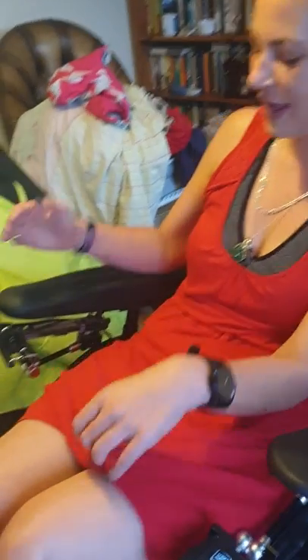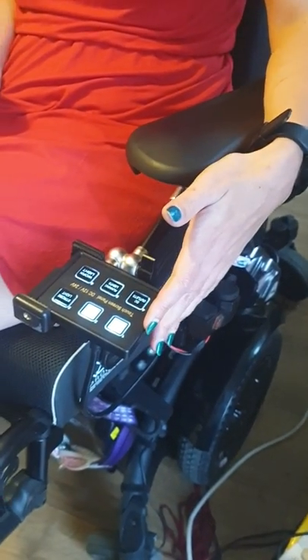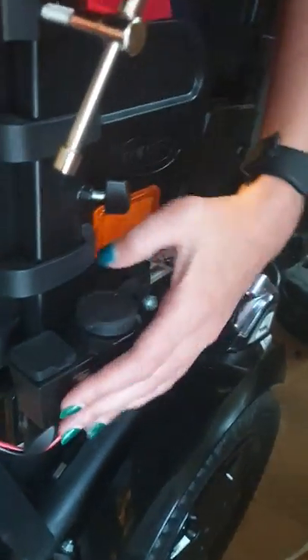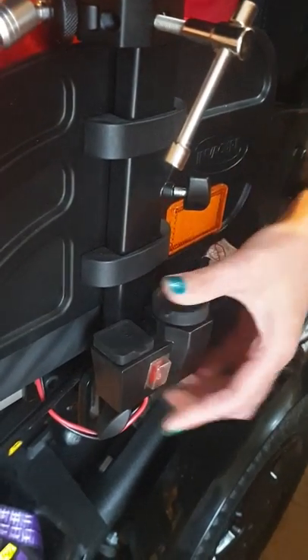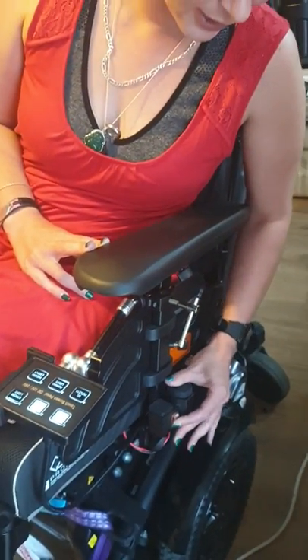We're going to do something about that because we've got other features on it. That's still better than my old horn though. We're going to do stuff on that. And you've also got a phone holder next to it. Yeah, I do have my phone holder. And on this side I've got my power for my accessories. I've also got my switch — a cigarette lighter plug there — and two USB chargers, and of course they're waterproofed.